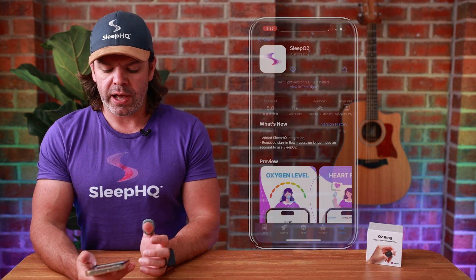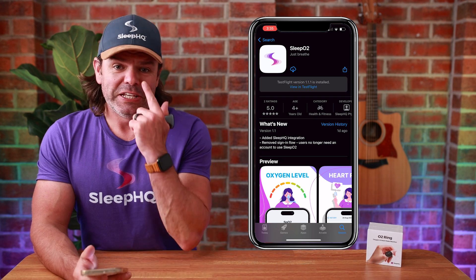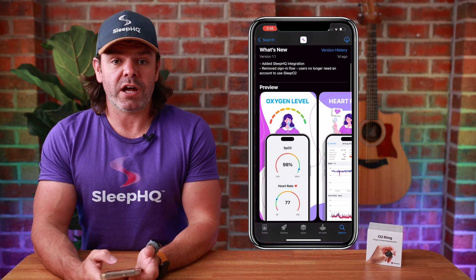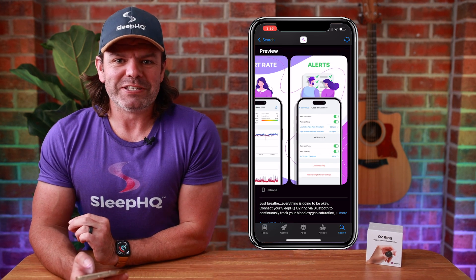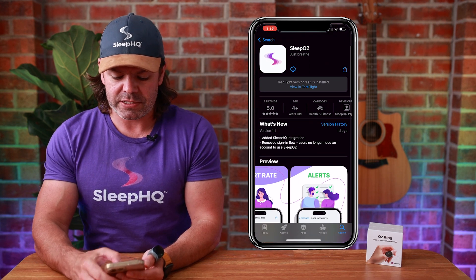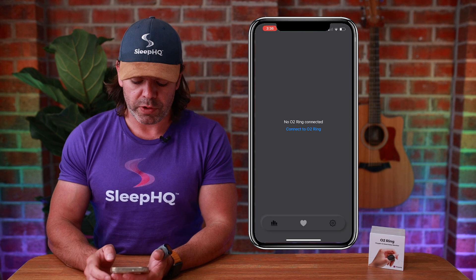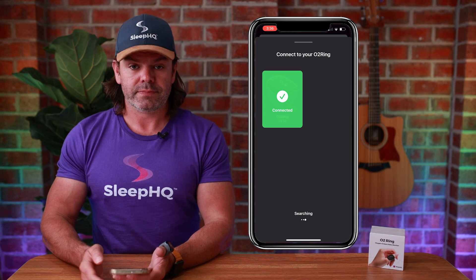Here we are on the App Store with our brand new Sleep O2 app — tears of joy running down my face, it's a really proud moment. If you'd like to give us a five-star rating, go for it. Currently we've got two ratings — me and Adam of course. Download it to your phone. It will ask for permission to connect to Bluetooth, so connect to Bluetooth, then connect to your O2 ring. Click your O2 ring and it's connected, then just swipe down and we're on.